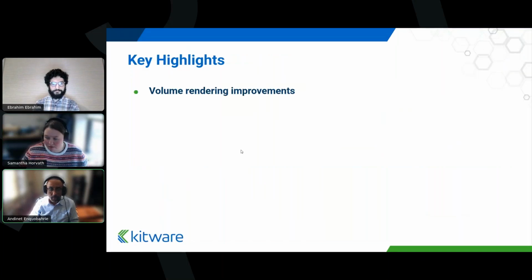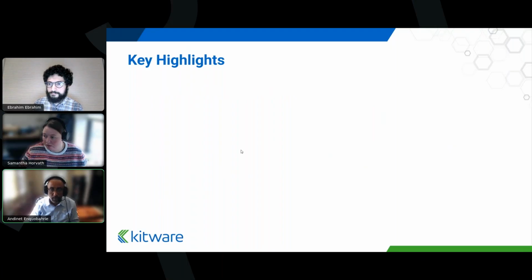Sam, a question came in. So the new extension modules, do they get built across all the different platforms?